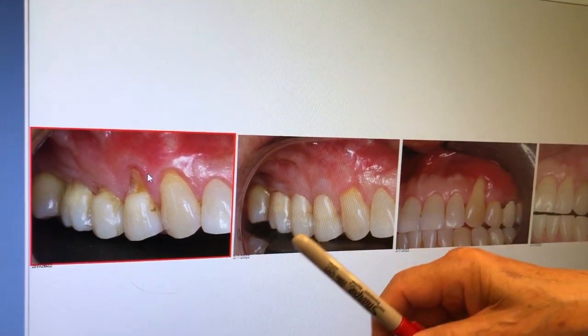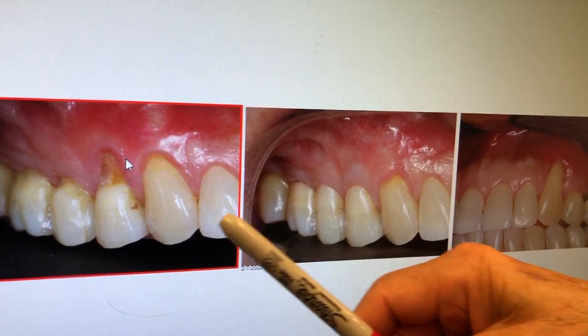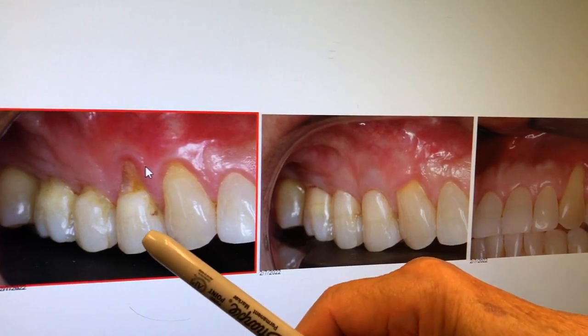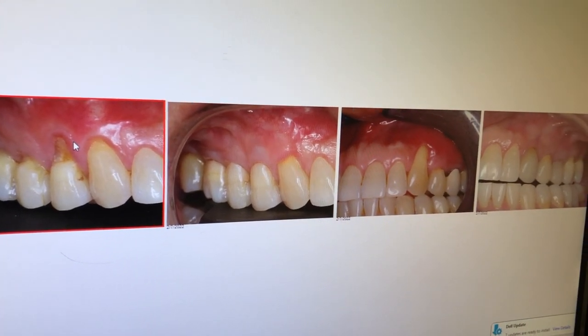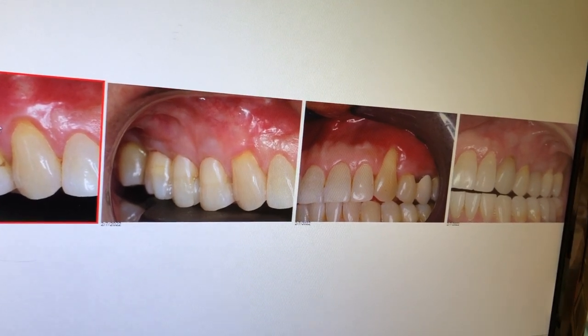Look at this here and look at this here. Look at also number six. Number six is also very much shorter than it was before, but the target was number five. Now, on the opposite side, we have number 11.